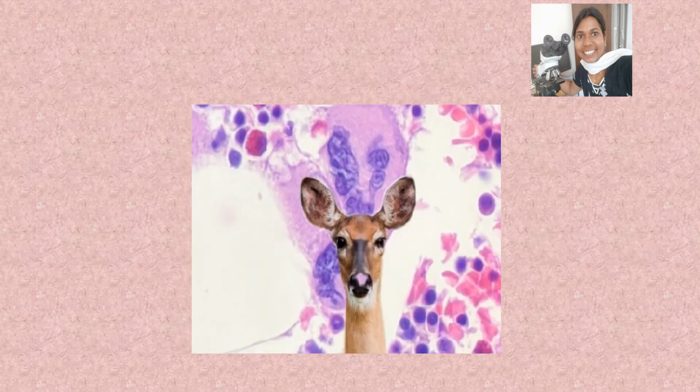Okay. So another thing. So let me tell you, this is a bone marrow aspirate from a patient who presented with burning pain in the feet, legs, and then he had thrombosis in the portal vein. So any guess what it is? So this is called Staghorn megakaryocyte. So what do you mean by Staghorn megakaryocyte? So when you normally look for megakaryocyte in the bone marrow aspirate, how do they look? So they will have multiple nuclear lobes, okay? So they will be connected to each other. About 4 to 5 lobes can be there or sometimes 6.